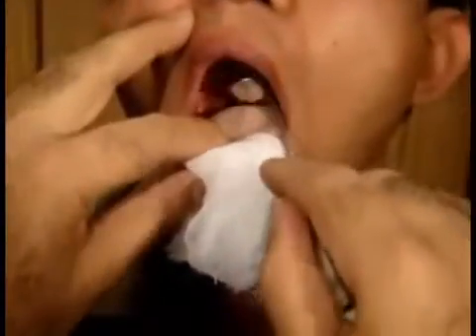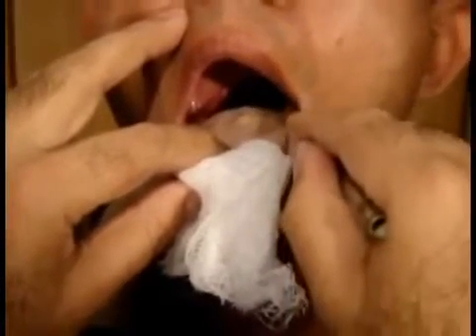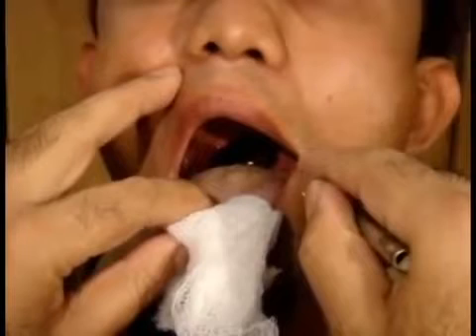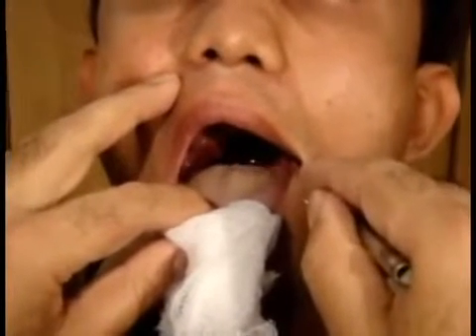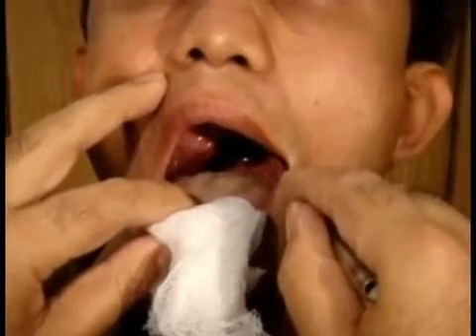Open your mouth, bring the tongue out. We will hold the tongue with the help of this gauze. Then we will recheck the mirror, and then we will put the mirror facing downwards into the throat of the patient. Push the uvula back, then we'll ask the patient to say "ee." Say "ee." Take a long breath, then "ee."